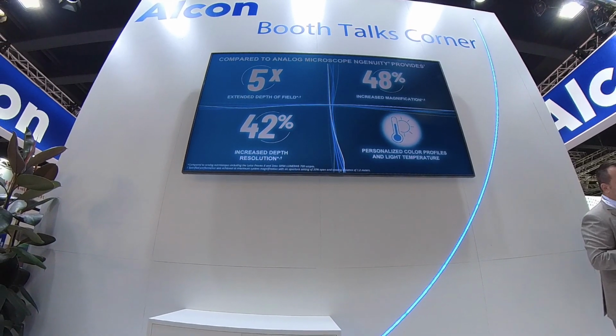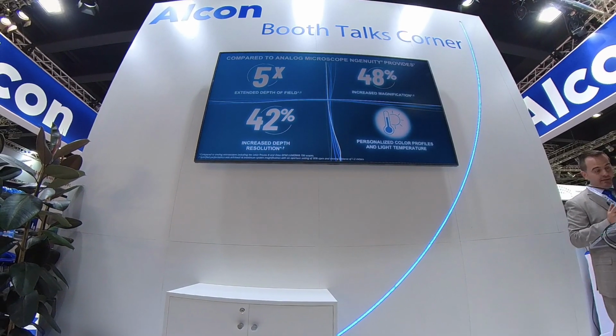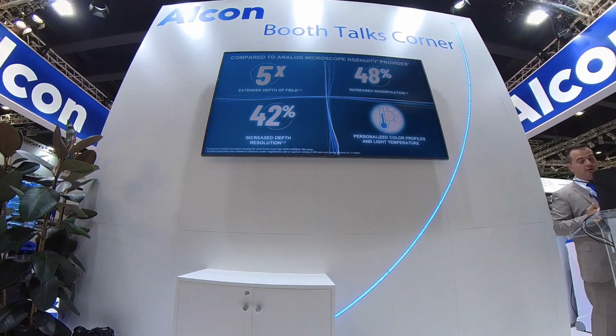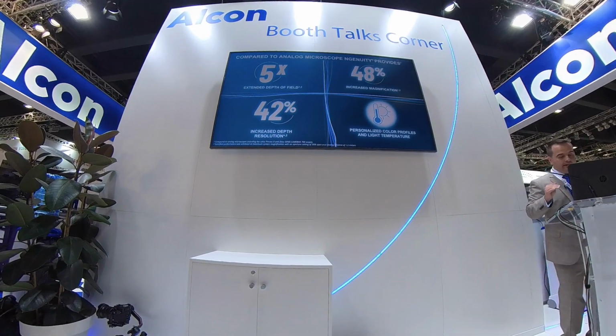48% increased magnification compared to the traditional analog microscope, and the most important thing, in my opinion, are the personalized color profiles and light temperature, because we might do a lot of things with this, and I will show them in my presentation later.